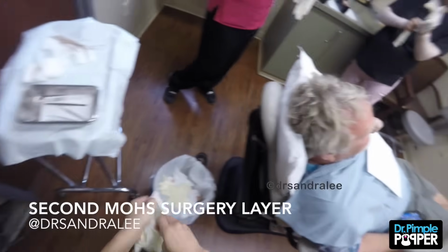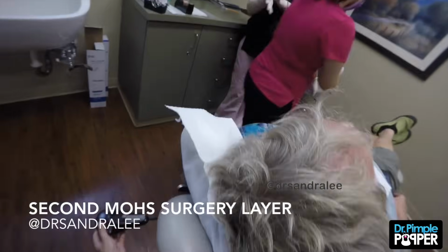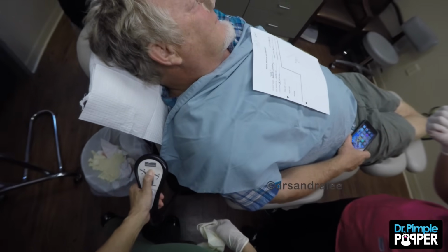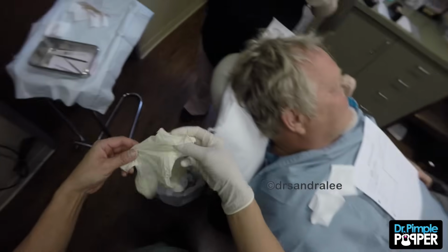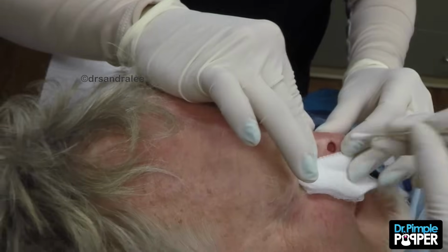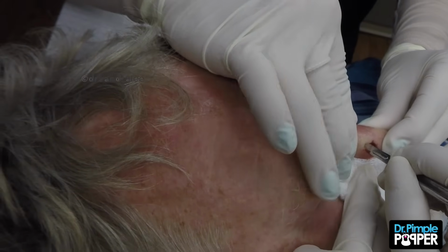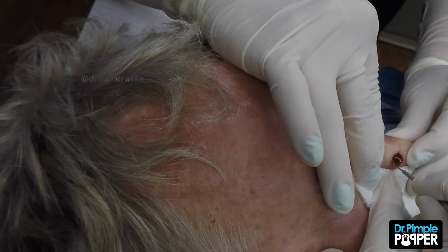I'm going to take a little bit more on one edge here, so I'm going to make sure we have a little more numbing on you first. We're getting the stab with the needle. We do. It's not your last either today. What? You got a few others, because we're probably going to put some stitches here and fix you up. Oh, sweet. I love stitches. You do. Good. I'm going to take that bandage off of you. Red blood there on the inside. Good. She's stretching that area, and so I know it's on this top edge, so I'm going to take a little more from here. Make sure nothing's sharp, okay? Nothing sharp or uncomfortable. Good.